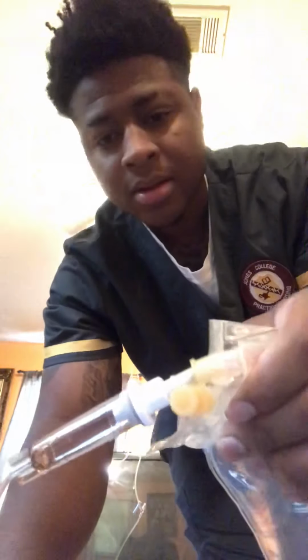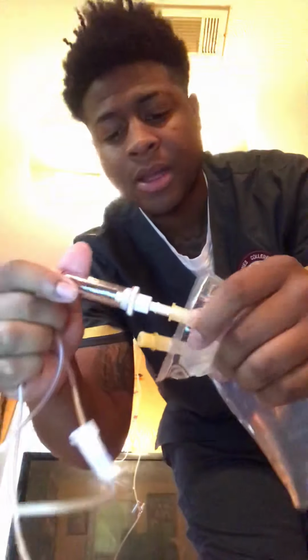So what you want to do is grab your tubing, take that off, of course, and dispose of that paper, and grab your medication, pull this covering off without contaminating it, dispose it, pull the cap over the spike off and dispose it, and then push that in there till it connects right there at that lip.